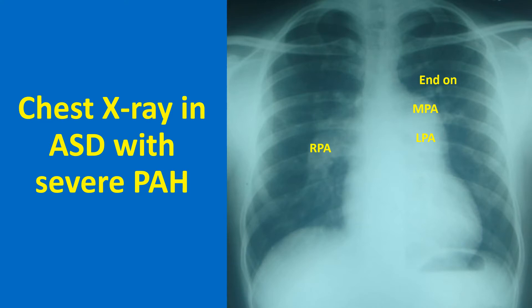X-ray chest PA view in atrial septal defect with severe pulmonary hypertension shows prominent main pulmonary artery, right pulmonary artery, and left pulmonary artery behind the main pulmonary artery, with end-on views of dilated branch pulmonary arteries. Echocardiography documented a large secundum ASD with severe pulmonary hypertension and bidirectional shunt across the ASD. There is mild right atrial enlargement and the configuration of apex is right ventricular. Absence of significant cardiomegaly would suggest that pulmonary hypertension developed early before a very large shunt was established.